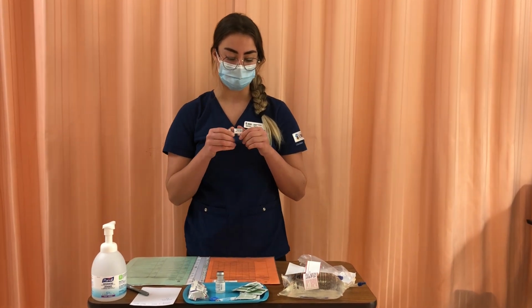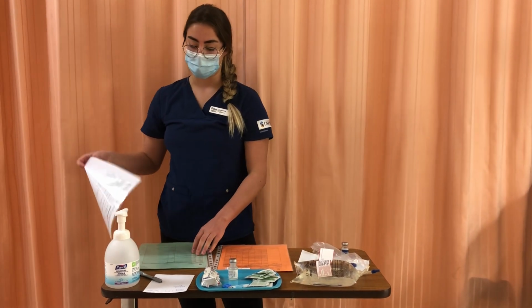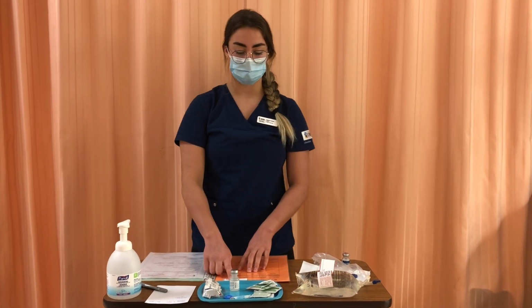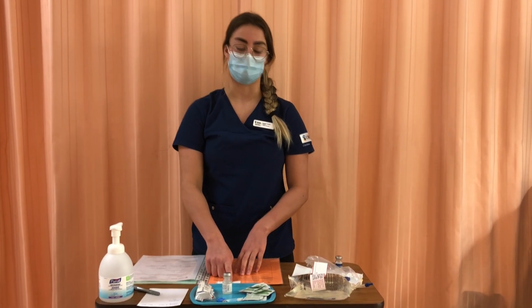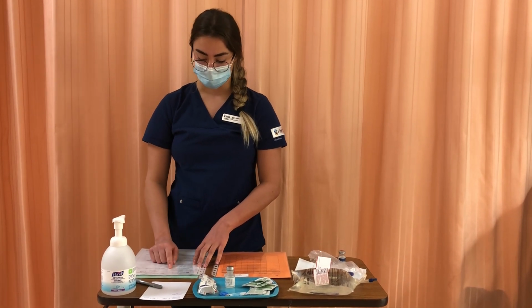I'm going to check to make sure it's not expired and that the vial's intact so I can use it. I'm also going to take a look at my PDM for Azithromycin, which is an antibiotic. We're giving it to Benicio Vines for their cellulitis from their scratch on their arm. So it can be administered by a nurse or a student nurse.